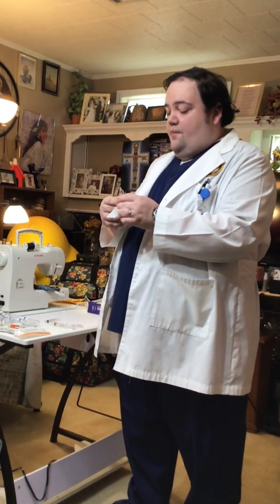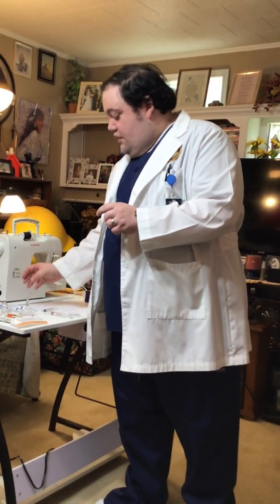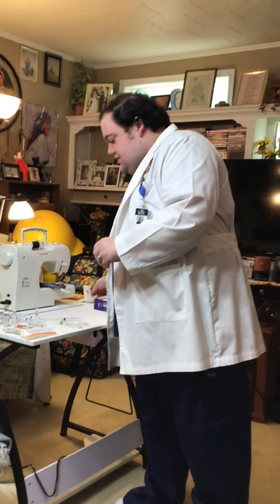So to be safe, when you break an ampule, you always want to use a filter needle to draw the medication out. I do not have a filter needle, but since this is a demonstration, we're going to pretend this regular needle is a filter needle. All right? And the way we aseptically do this, we're going to peel the package back just like this. We're not going to touch anything else, and we're going to lock our syringe on there. All right. It's not contaminated.